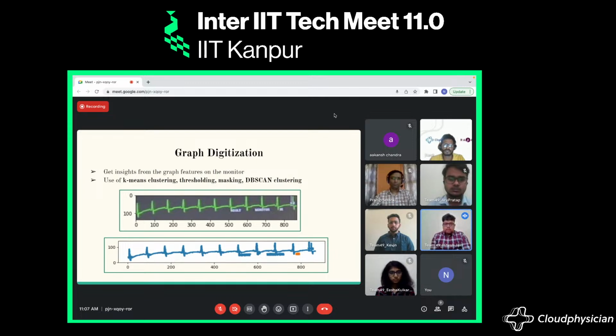Then we apply the DBSCAN algorithm to cluster the graph points based on spatial proximity, and labels are assigned to distinguish each cluster. The visualization makes it easier to identify and interpret the data patterns and group them into meaningful clusters, helping us eliminate any unwanted noise present in the graph. As you can see, this is the bounding box for the heart rate graph, and after applying the graph digitization function, we get a graph like this. Here we have two colors, one blue and one orange. It separates noise in the form of colors so that we can easily see what kind of noise is there in the original image.